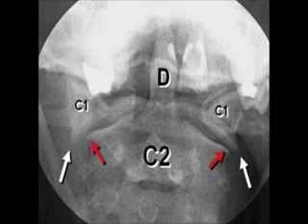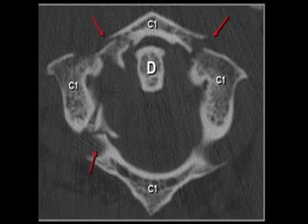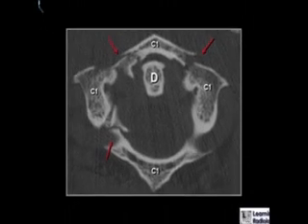When you see this on a frontal radiograph in a patient with trauma, this indicates a Jefferson fracture — a burst fracture of C1. Here's a CT scan of the same patient in which we can see both the right and left fractures of the anterior arch. We can only see the right posterior arch fracture on this image.